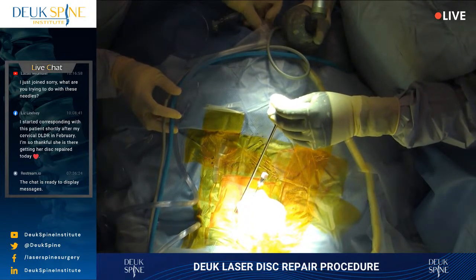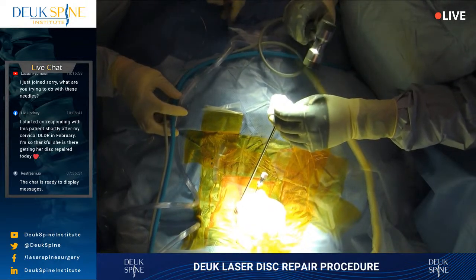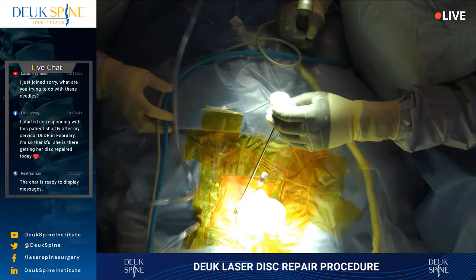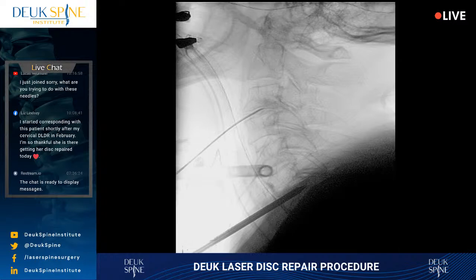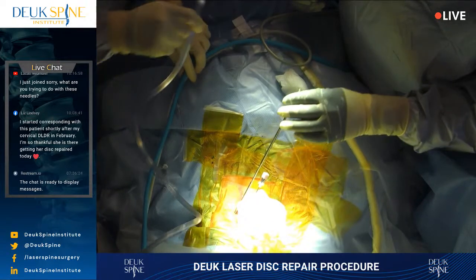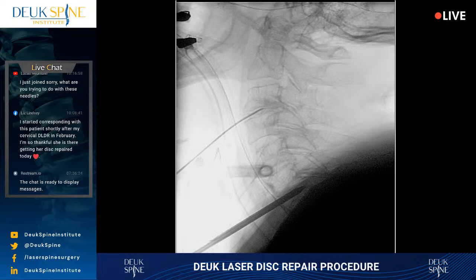All right, so I'm advancing the tube through the disc. You can see that the tip of the dilator is not moving. I'm checking my C3-4 needle as well, which is slightly deviated from the tissues being pulled south by this process right now, but it's still anchored in a good spot in the middle of the disc. All right, I'm just about to the back of the disc here with my tube. Yep, almost there, and I want to advance my dilator just a few millimeters so I can get my tube a little further in. Shot.